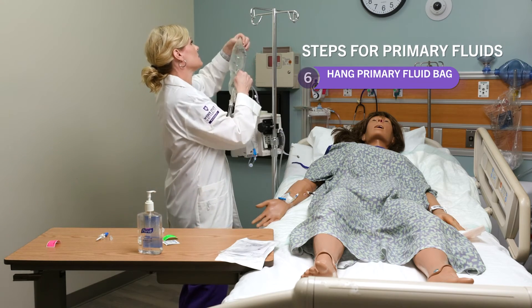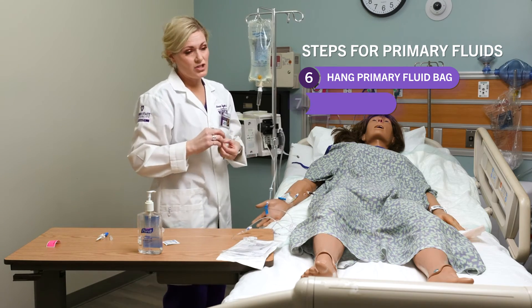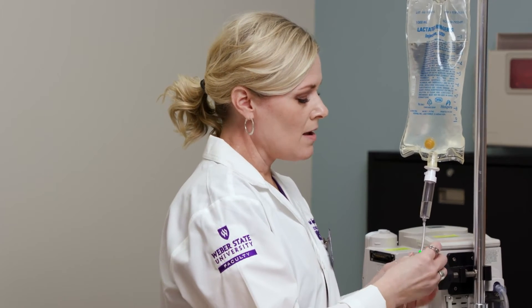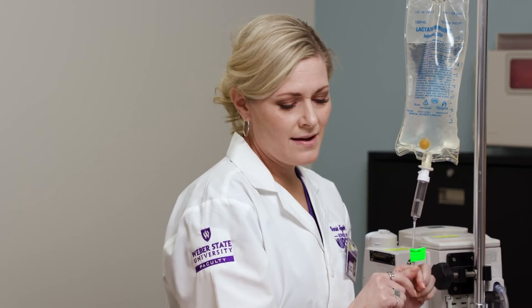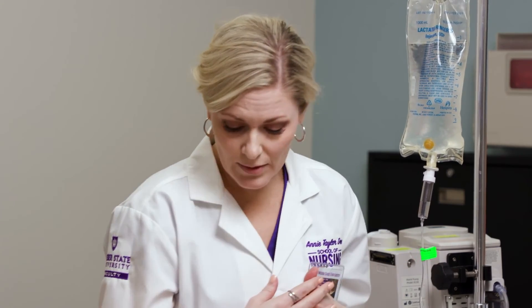I'm going to hang it and put my label on just so I don't forget. Some medications and fluids you'll also put a label of what it is, so that you can look at it at a glance and see what that fluid is.